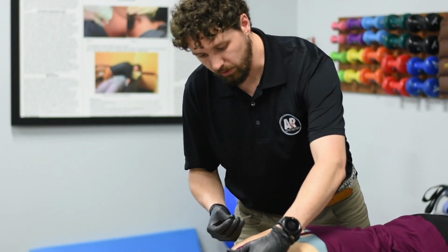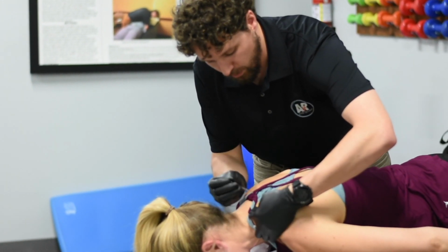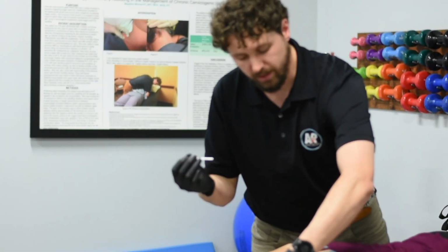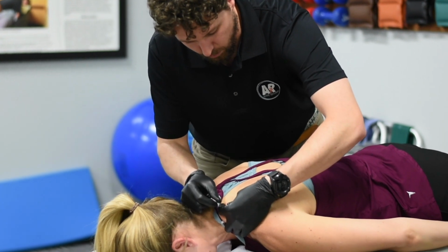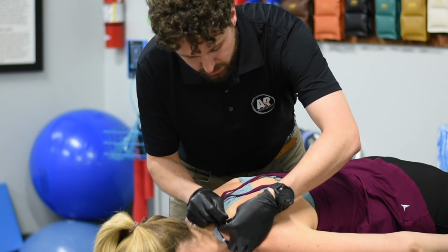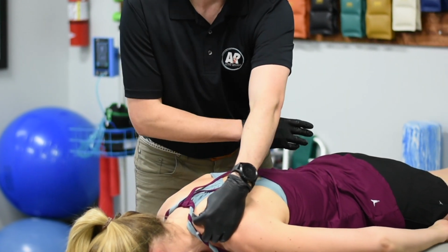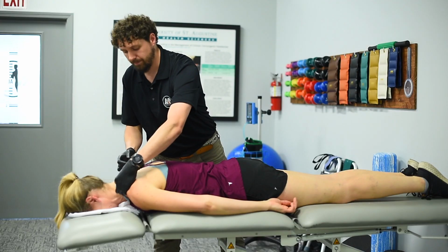We'll start here on her left trap and just grab the muscle. We maybe find, okay, we feel a little trigger point there, so that's where we want to go. As we get the needle in the area that we want, there's a couple different techniques that we might use. Sometimes I will just place the needle and leave it and use a little stim machine to make that muscle jump, which I'll show you here in just a second.